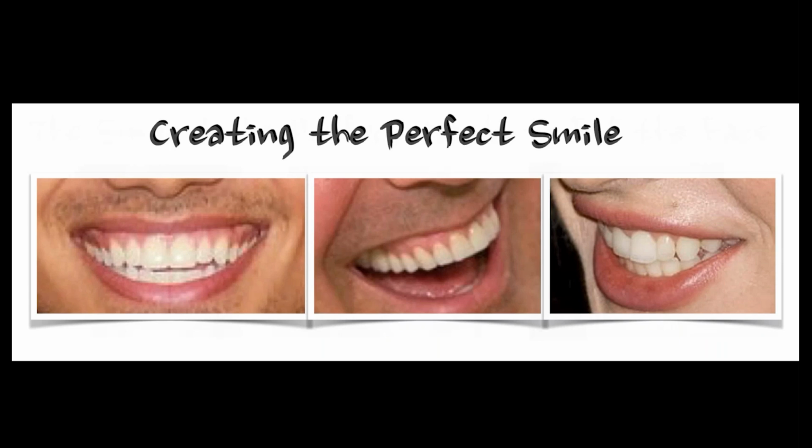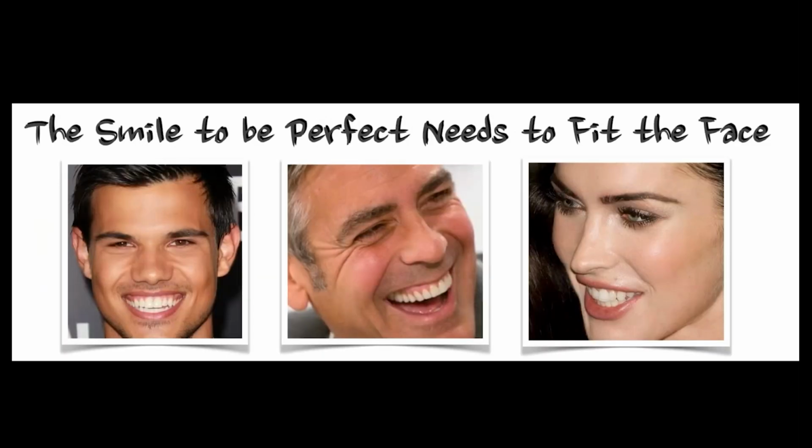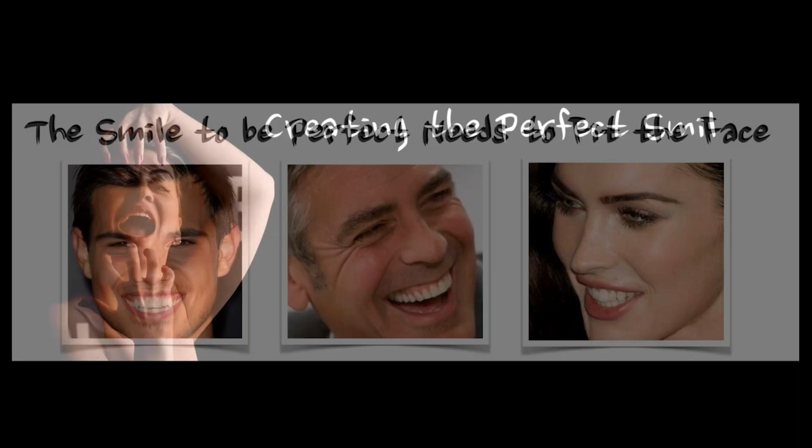And I think it's important for us to realize that really what makes the smile work is how well it fits into the face. It's not about how straight the teeth are, how white they are, how long they are. It's really more about how well they fit into the patient's face. And this is a perfect example of that. So this is Olga, and Olga is a patient that I recently worked on.